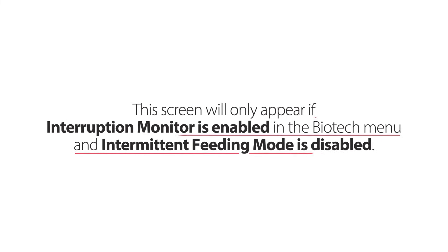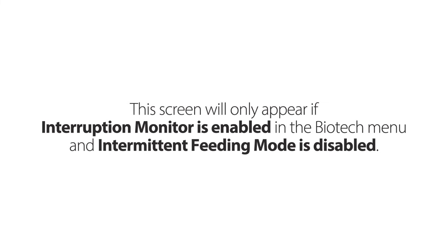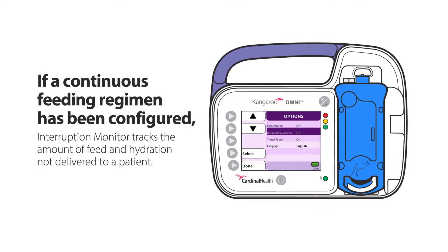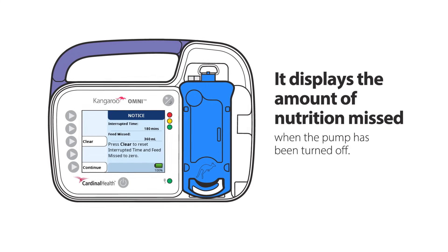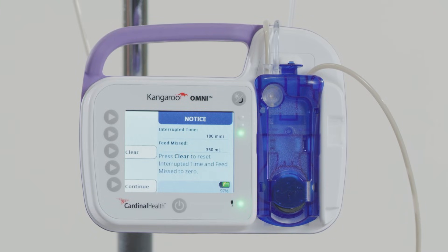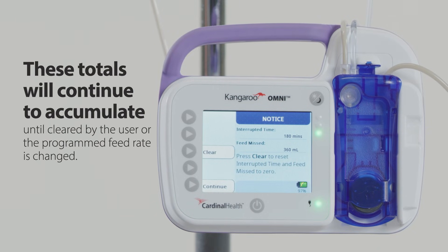This screen will only appear if Interruption Monitor is enabled in the Biotech menu and Intermittent Feeding Mode is disabled. If a continuous feeding regimen has been configured, Interruption Monitor tracks the amount of feed and hydration not delivered to a patient and displays the amount of nutrition missed when the pump has been turned off. If Interruption Monitor is enabled, a notice screen will be displayed if the pump has been stopped, turned off, or flushing for longer than 30 minutes. It will show the interrupted time and feed missed volume, and these totals will continue to accumulate until cleared by the user or the programmed feed rate is changed.